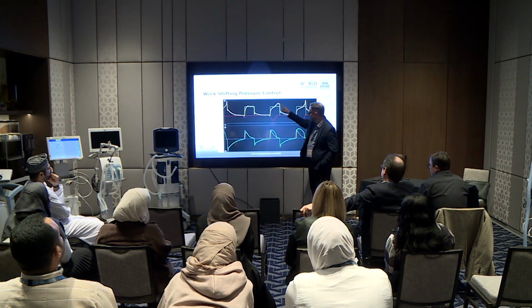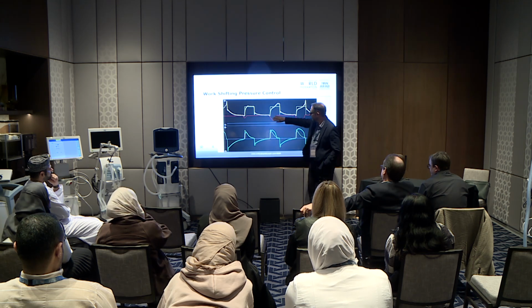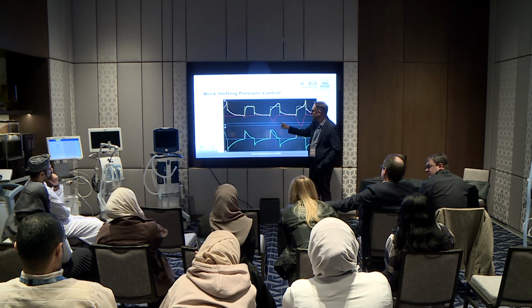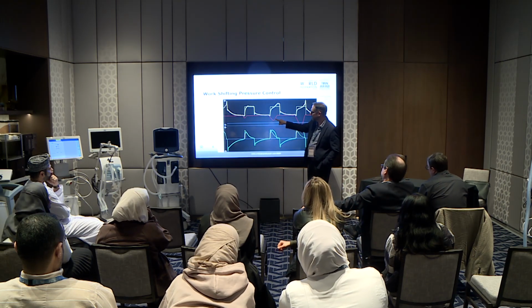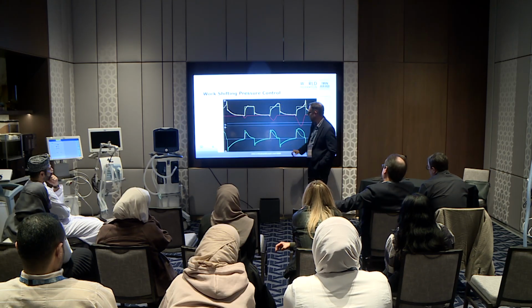Notice how there's a plateau here. It's because there's a pause, and this is the elastic recoil. So again, if I didn't see that, I see this is happening and I see this pause, this is like doing a plateau pressure, right? And all it's reflecting is the elastic recoil of the lung. So this is actually your true driving pressure in this patient.